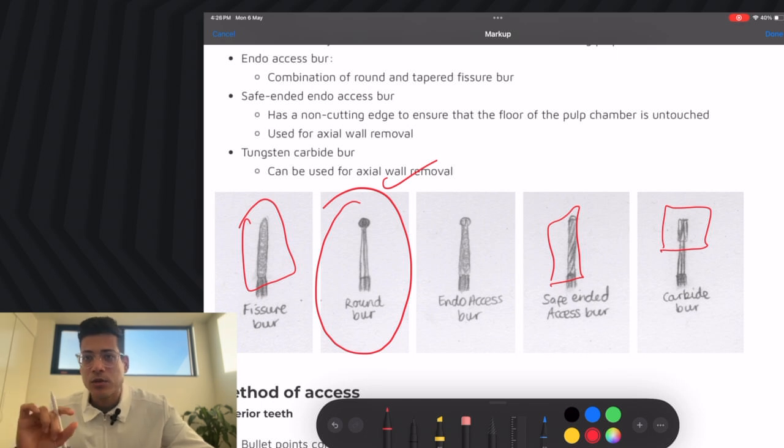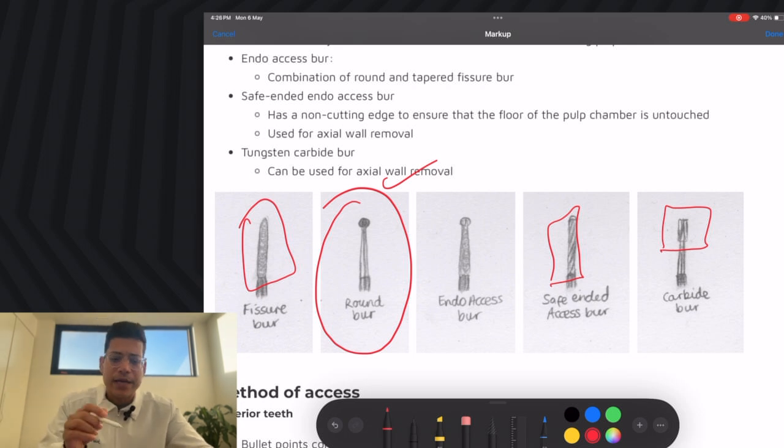You just want initial opening. Make sure you follow the outline. You have a straight line axis. You're not leaving any roof. And at the end of the day, it doesn't matter how the tooth looks. You should follow the grading criteria. Keeping it simple like that.